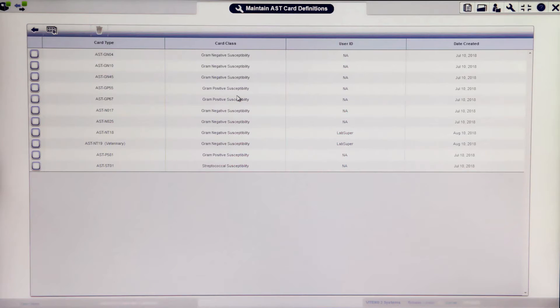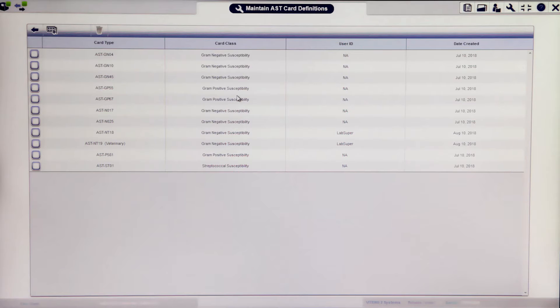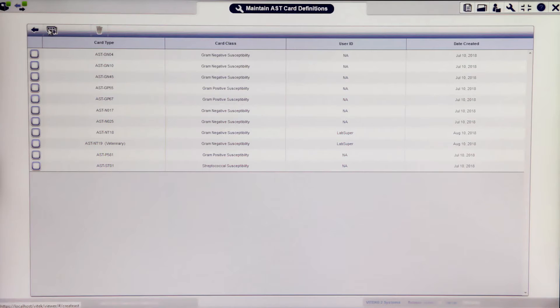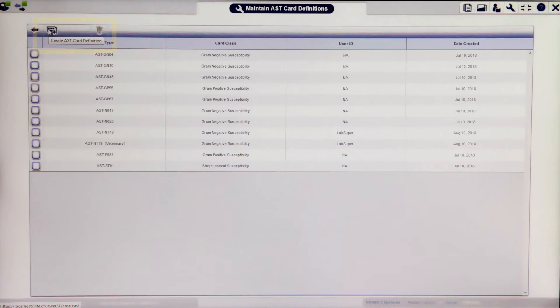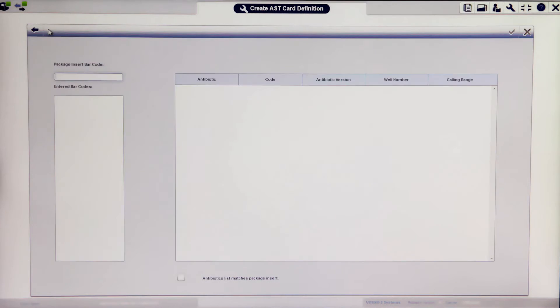The screen that displays lists all the AST cards defined in the Vitek2 system software. To add a new card type, click on the Add AST card definitions button in the top left-hand corner of the page.